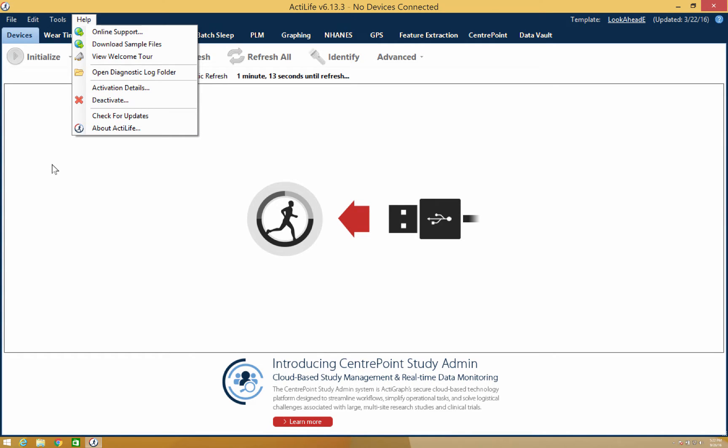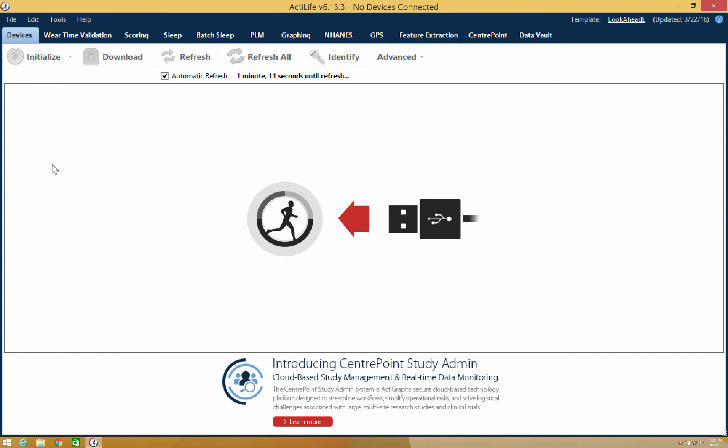Next, we are going to cover all the feature tabs in ActiLife, starting with the Devices tab.